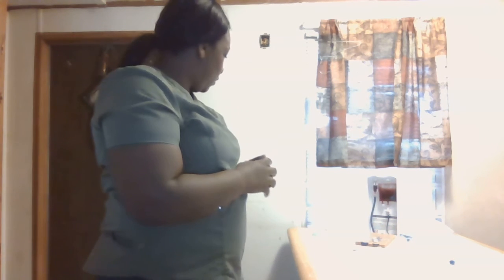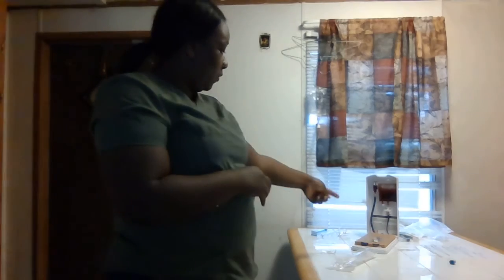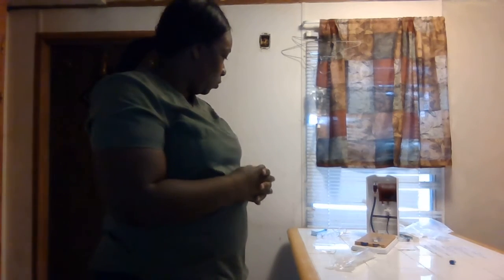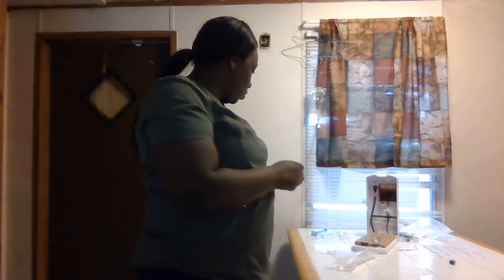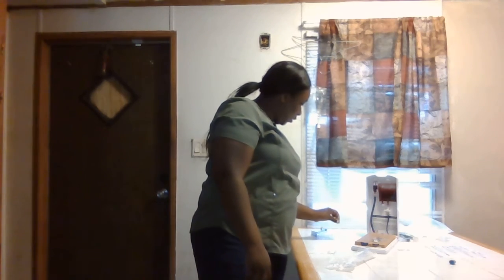Then when you're ready to hook it up to the patient, you want to definitely alcohol the end of the extension port and connect them like that. So clean. You're definitely going to clean the extension port here, and you're going to connect it here.